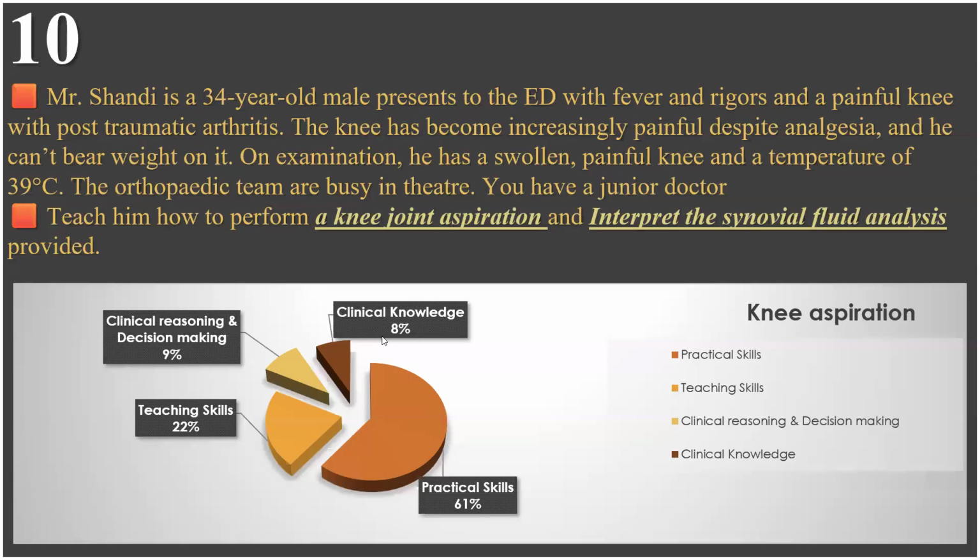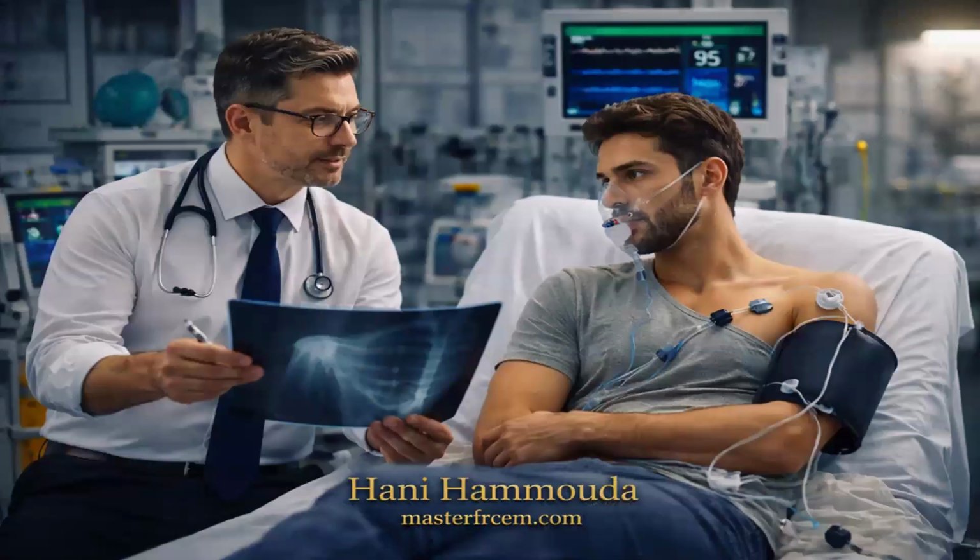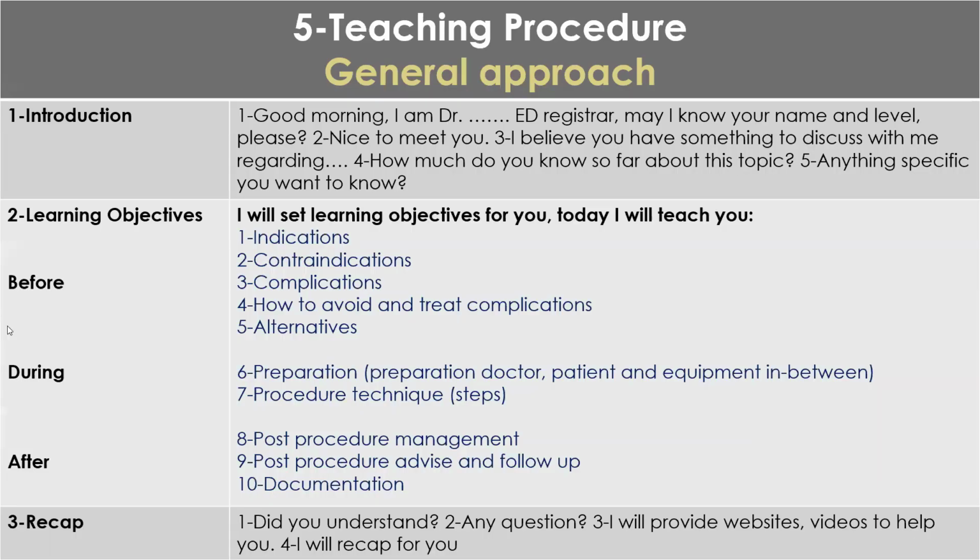Okay, this is knee aspiration. So for knee aspiration, you will follow the same general approach, okay? So here we have indications, of course, therapeutic and diagnostic. Therapeutic to relieve the pain and the swelling, and diagnostic to know the cause. So you will take a fluid sample from the joint.